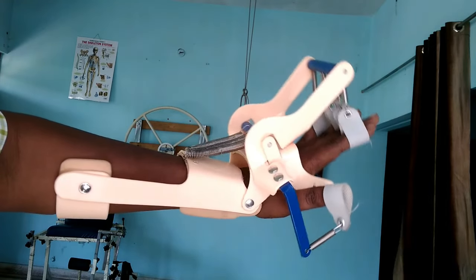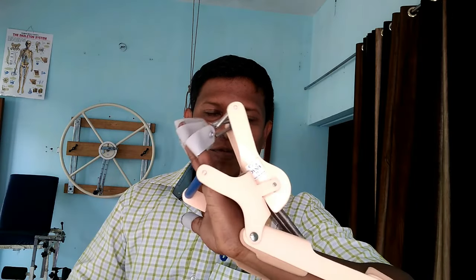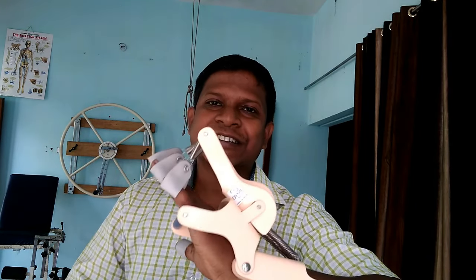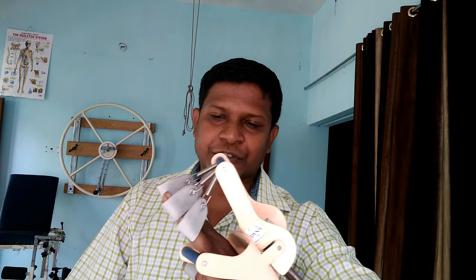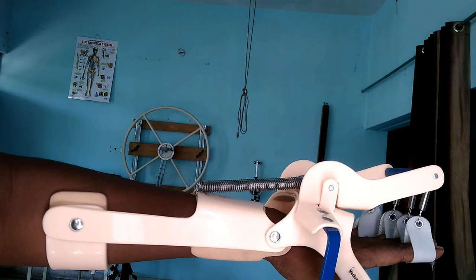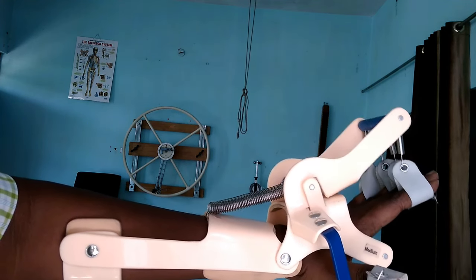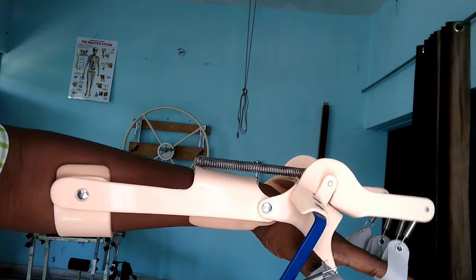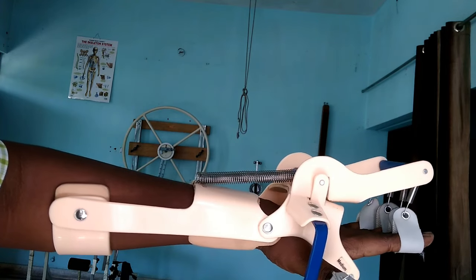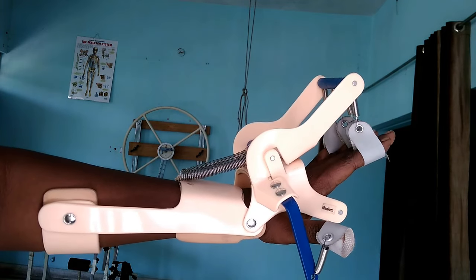The beauty of this product is that it allows movement at the wrist joint, which allows exercises and strengthening of the weak extensor muscles of the wrist joint. The spring on the upper part of the splint pulls the wrist into an extended position, helping to release the tightness of the wrist flexors.